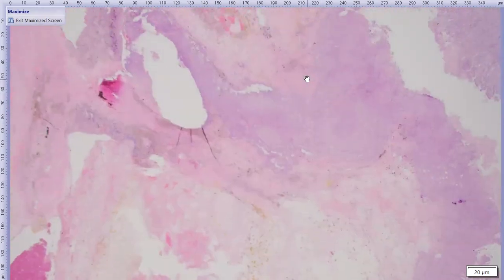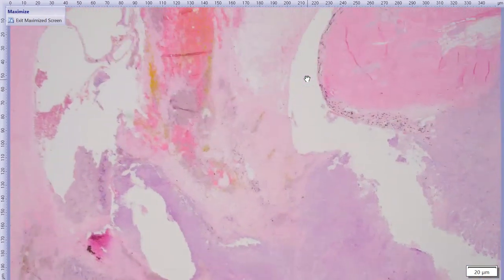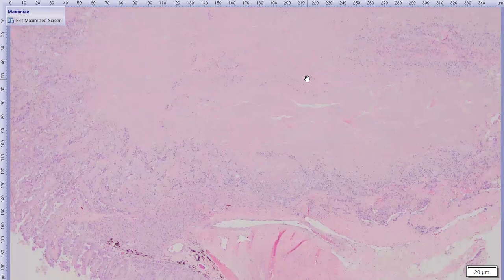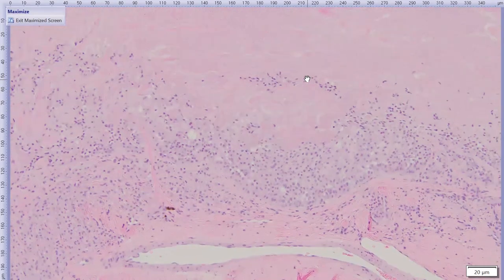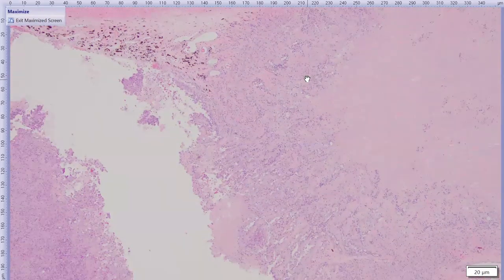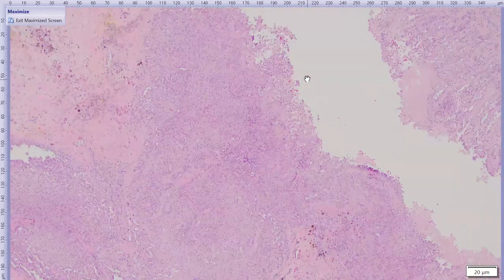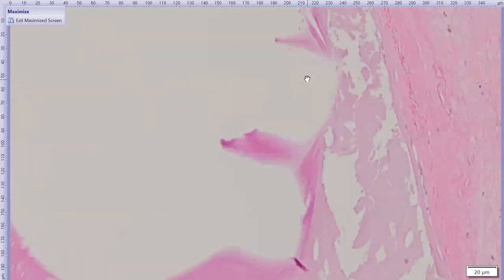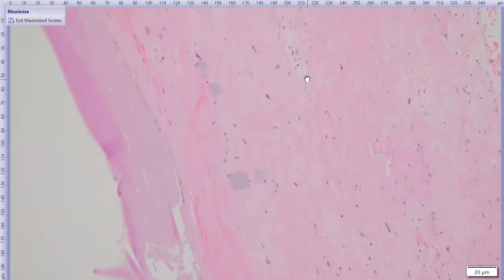Here's our hemorrhage with some hematoidin, the yellow pigment, and some of the brown pigment being hemosiderin. And then in this case, it actually comes out through the optic nerve that is really necrotic and extends out brainwards, heading out this way. So a pretty angry neoplasm, but still in the same vein of tumors. And again, we're happy to see our little asteroid hyalosis present in this case with this mass.